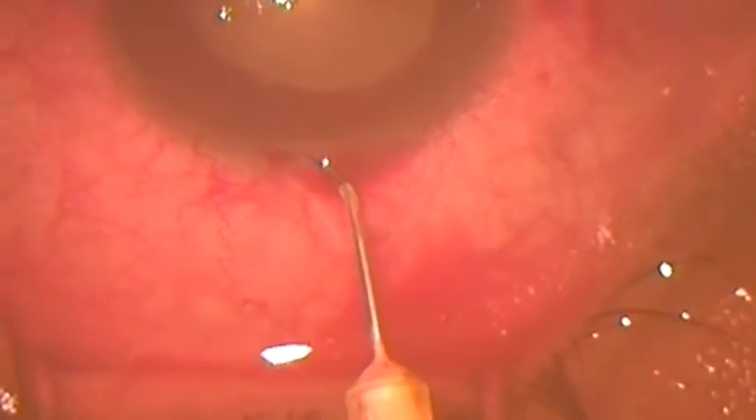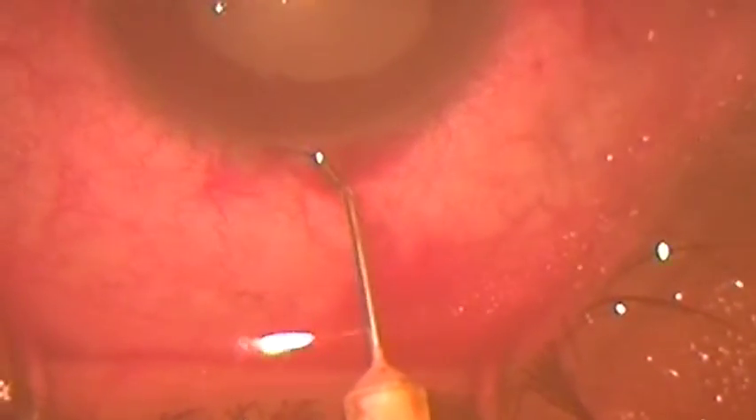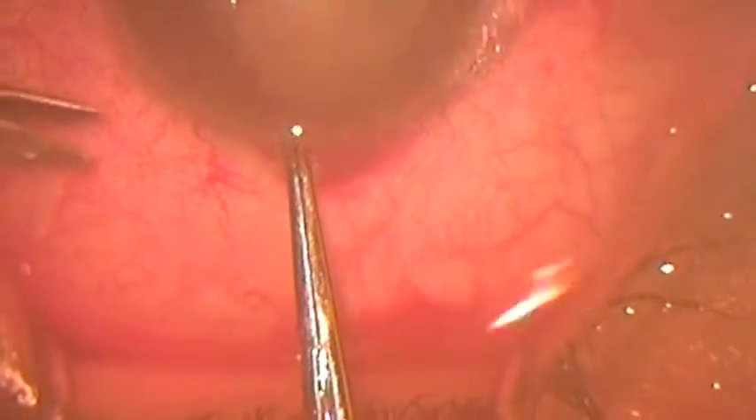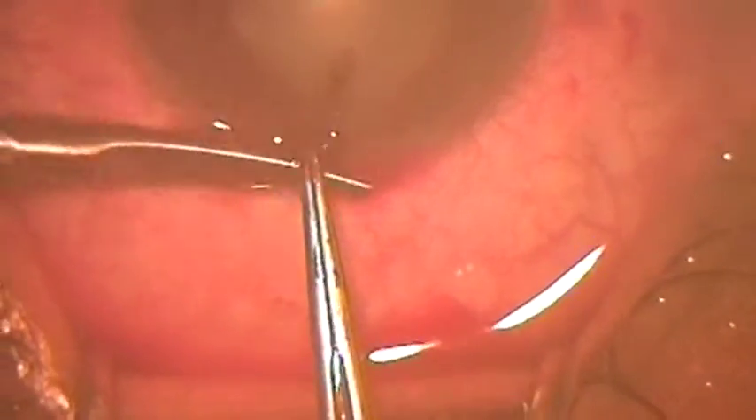We try to contract the pupil but there is no effect on the pupil size. Now we proceed to perform a peripheral iridectomy, as peripheral as possible.